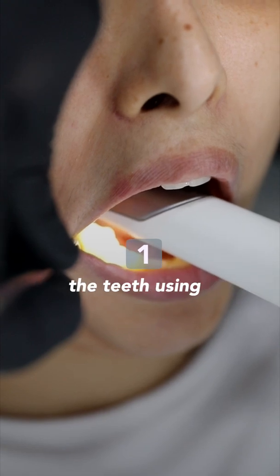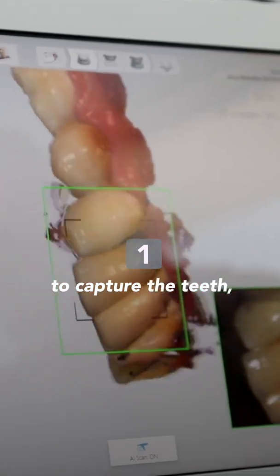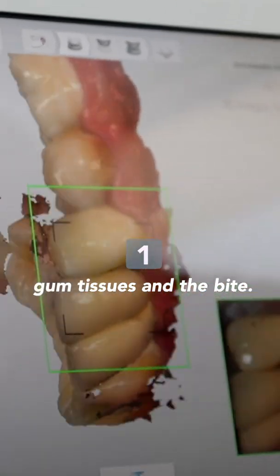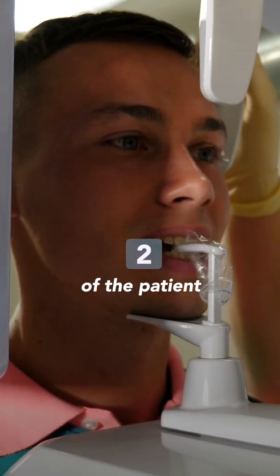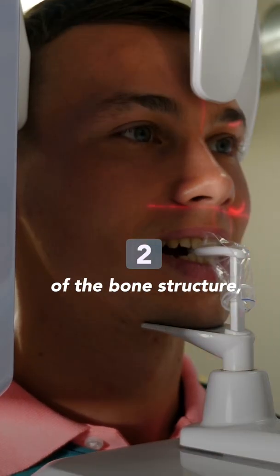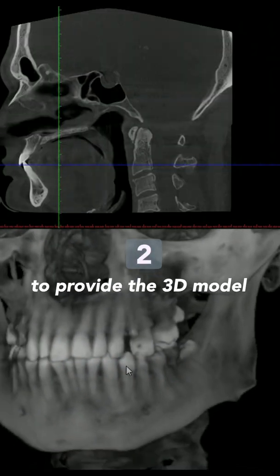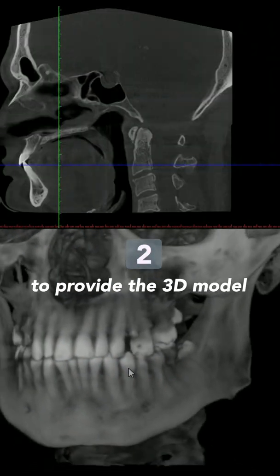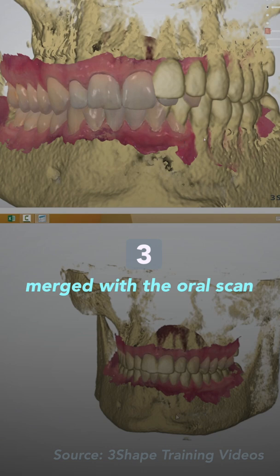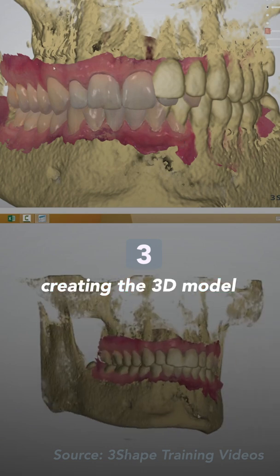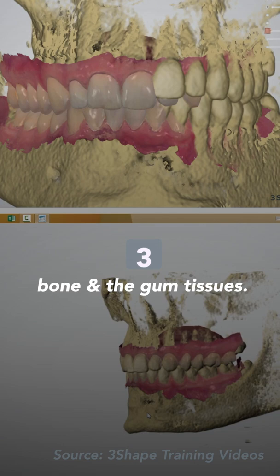The digital impression of the teeth using an intraoral scanner captures the teeth, gum tissues, and the bite. The next step is the CT scan of the patient to capture the anatomy of the bone structure, nerves, and sinuses to provide a 3D model of the bone. Then the CT scan is merged with the oral scan, creating a 3D model of the patient showing the teeth, bone, and gum tissues.